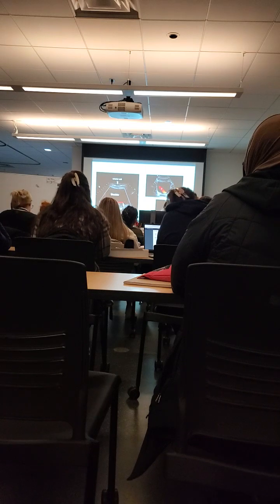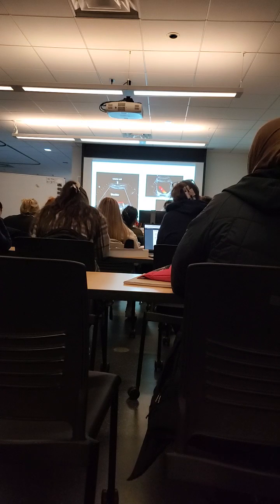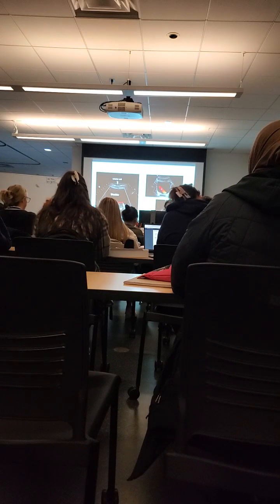And then your young, beautiful bodies are going to look like this. In fact, if I look at this picture closely, I'm seeing two. This person might have a duplicate ureter, which happens often. So I'm seeing two left ureters. But I don't know, because I'm not live. I have to go live to know that.